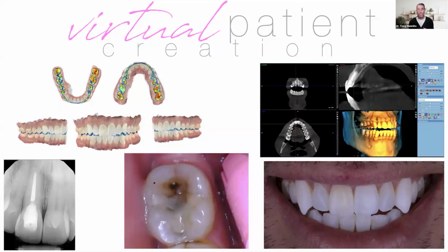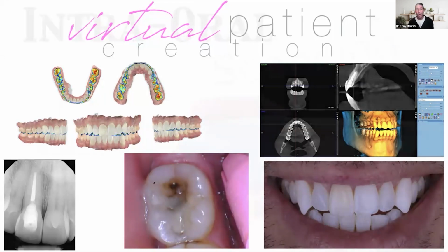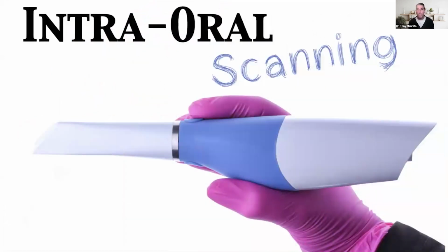The other thing is it gives us the ability to study the patient or treatment plan the patient when they're not in the office. We'll go a little bit more in depth on this, but I always like to start with intraoral scanning, because this is the technology I think most people have already implemented in their practice.